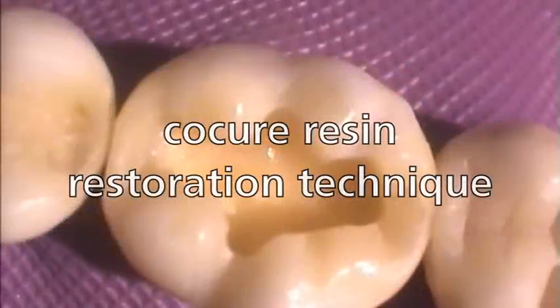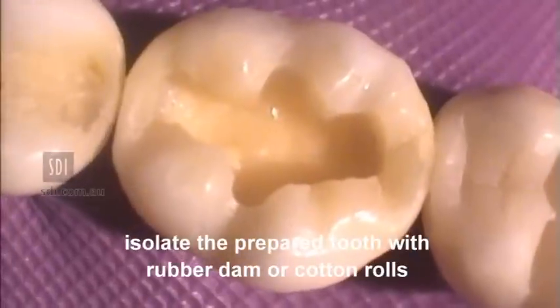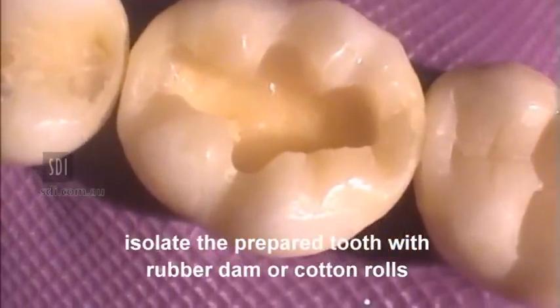Co-curing with RevaBond LC. Isolate the prepared tooth with rubber dam or cotton rolls.